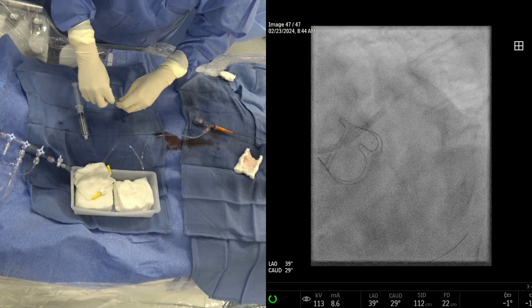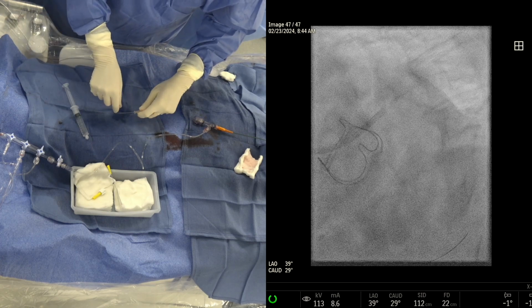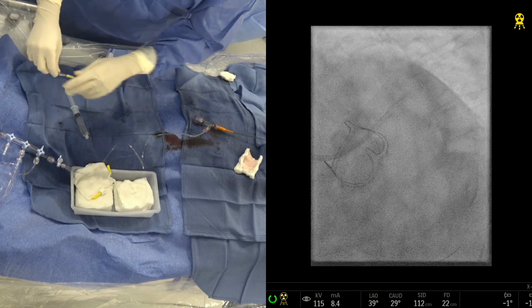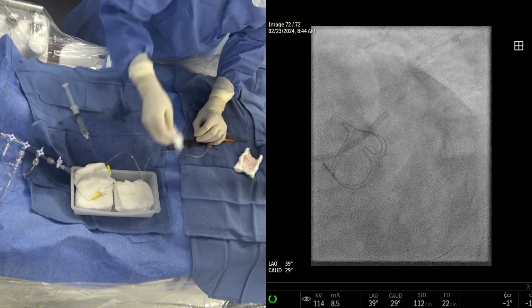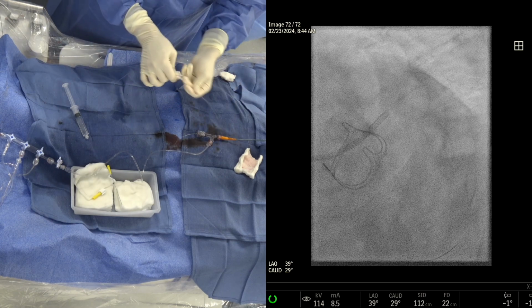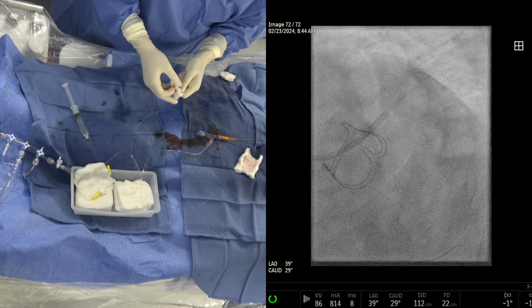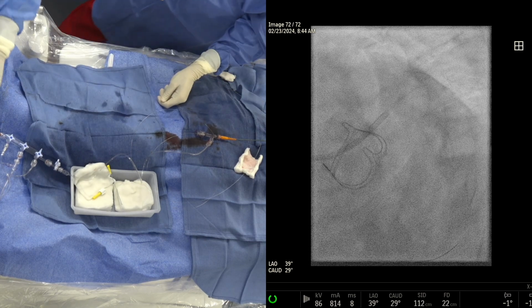Dr. Samin, I have a question for you. I'm asking whether you will also concentrate on the LAD lesion, because it is very eccentric and will be very ugly, I think. Yes, what happened is that in the earlier picture we could not see that clearly when the angiogram was done originally, but here there is a very significant LAD lesion. Will you go for IVUS in the LAD also? Okay, I will not do IVUS now.